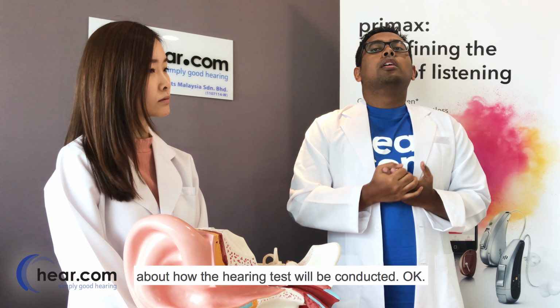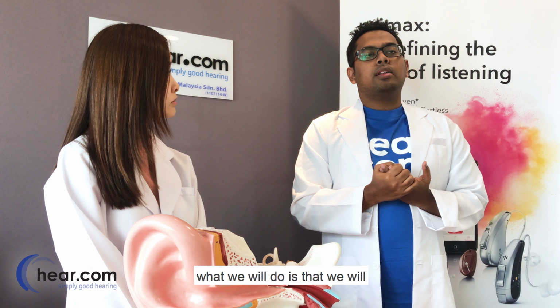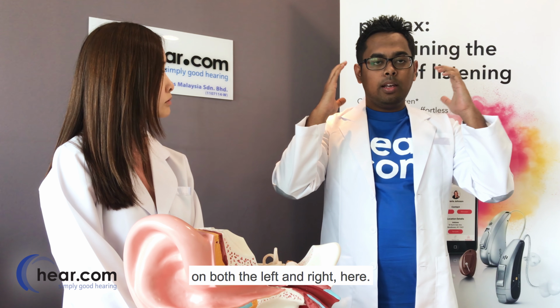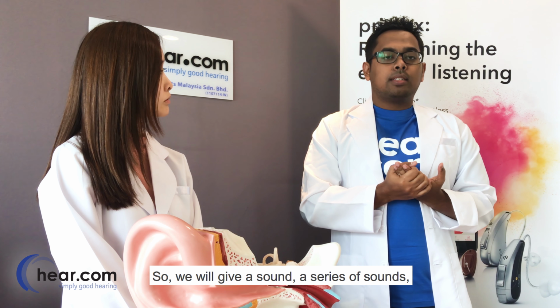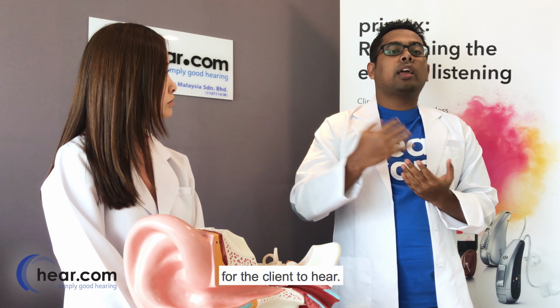be conducted. For the first step, during the test, what we will do is put the headphones on the patient, on both sides, left and right ear. So we will give a sound, a series of sounds, which means different types of sound and different types of frequency for the client to hear.